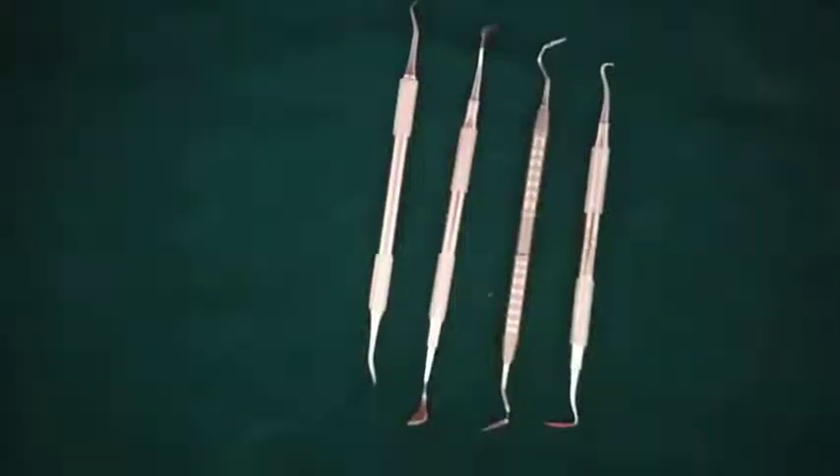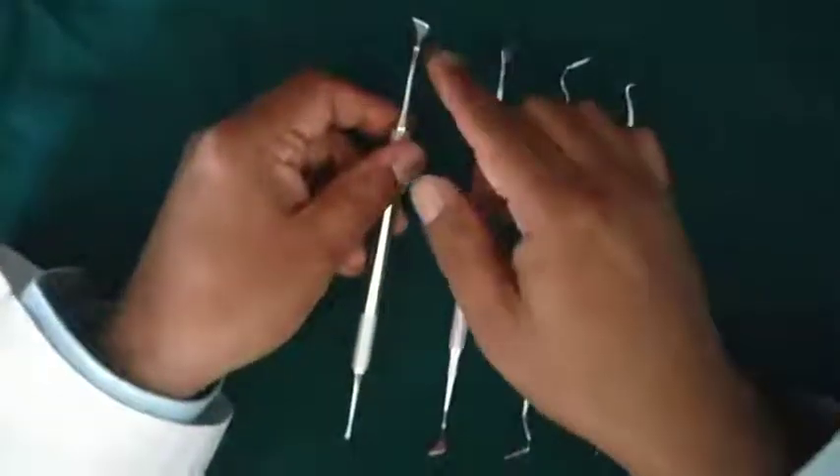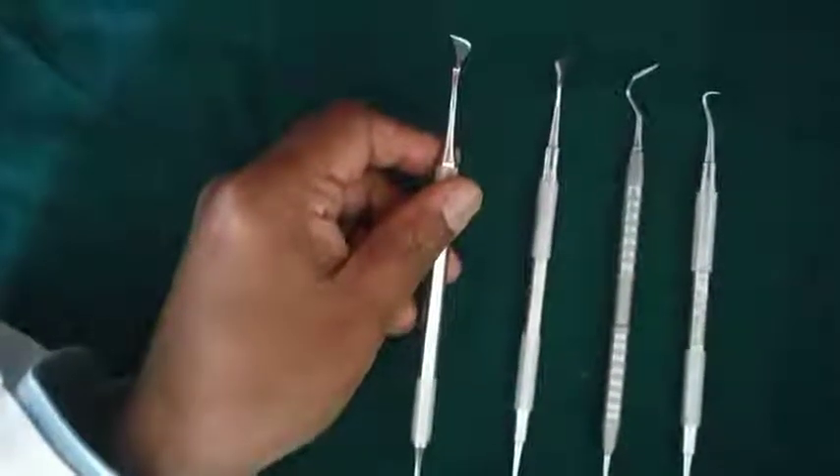The first knife which is commonly used is Kirkland's Gingivectomy knife. It has a kidney-shaped blade and it is used to give an external bevel incision in the gingivectomy procedure.